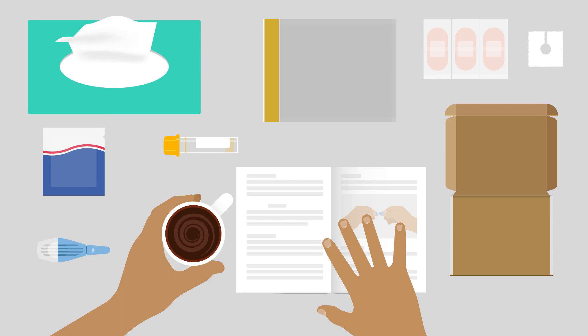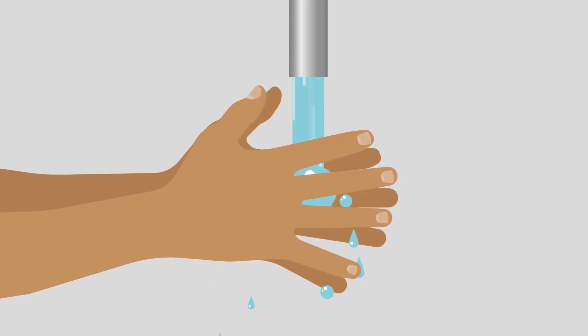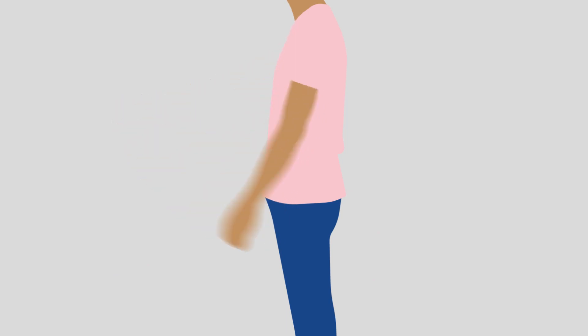Get some clean tissues and lay the kit out on a clean table. Wash your hands with warm water and dry them before you start. Then swing your non-writing arm three times to help the blood flow to your hand.